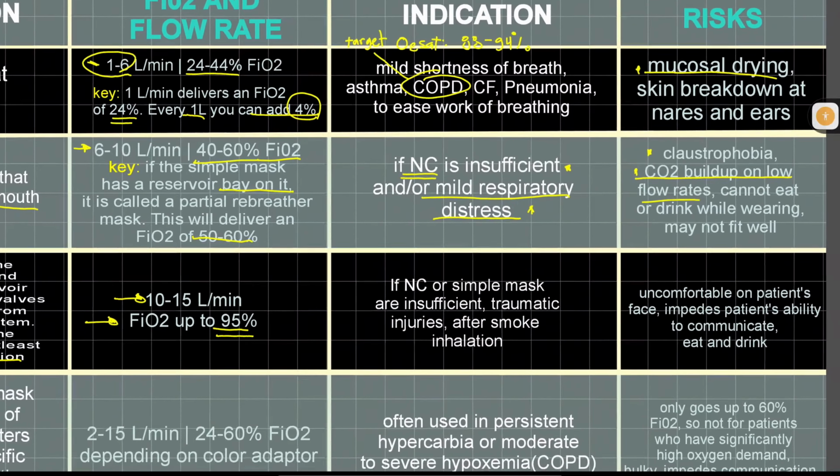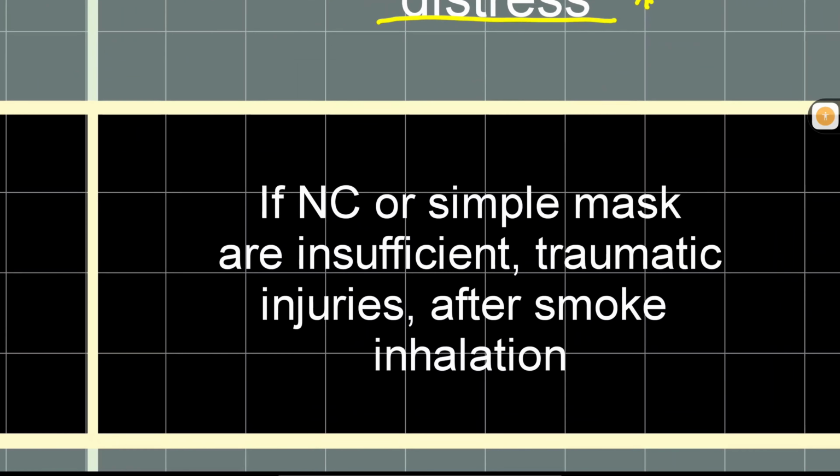So when are you gonna use a non-rebreather? So if nasal cannula or simple mask are insufficient, or any traumatic injuries, any RTA. Hindi siya indicated din sa mga may maxillofacial injuries. Kasi sa may kakabit, okay?